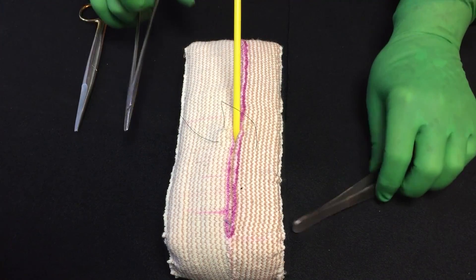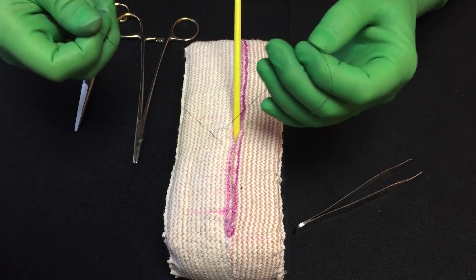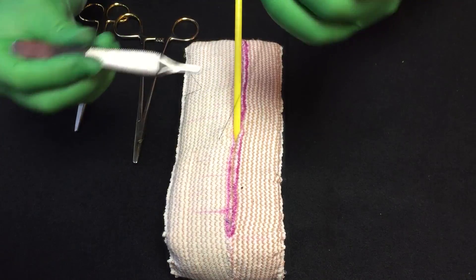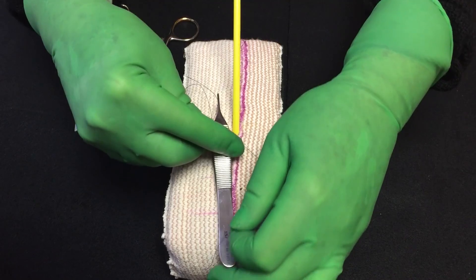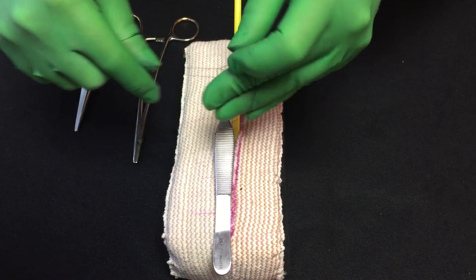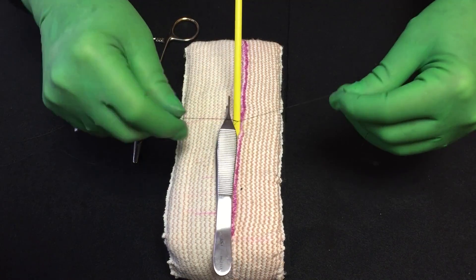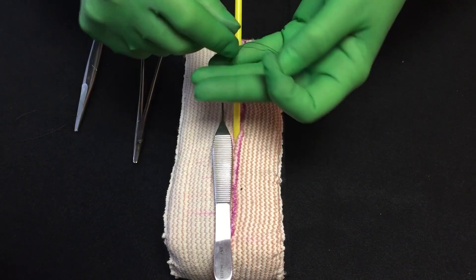Now I want to make a loop, but especially if you have something like nylon, it tends to slip easily so it would be hard to make a loop and keep it there. So I take my forceps and put the forceps in the way. It's a little bit harder to do it on this than on a person because you have a little more surface space on a person. So I take the loop and put it around the forceps and start tying it.